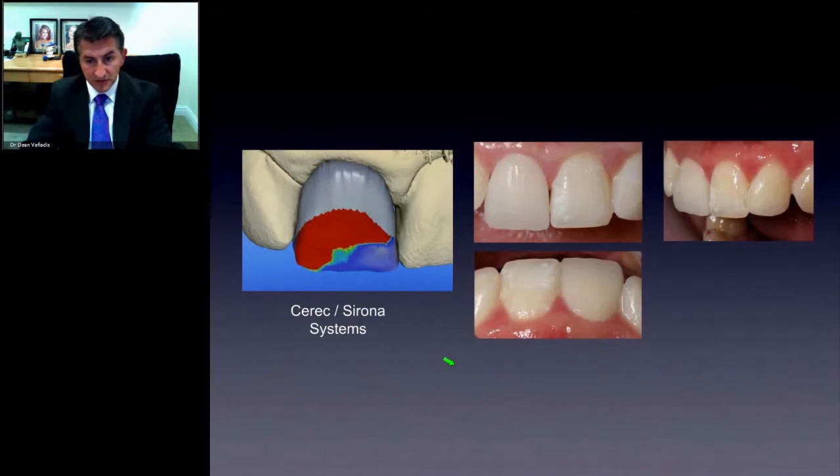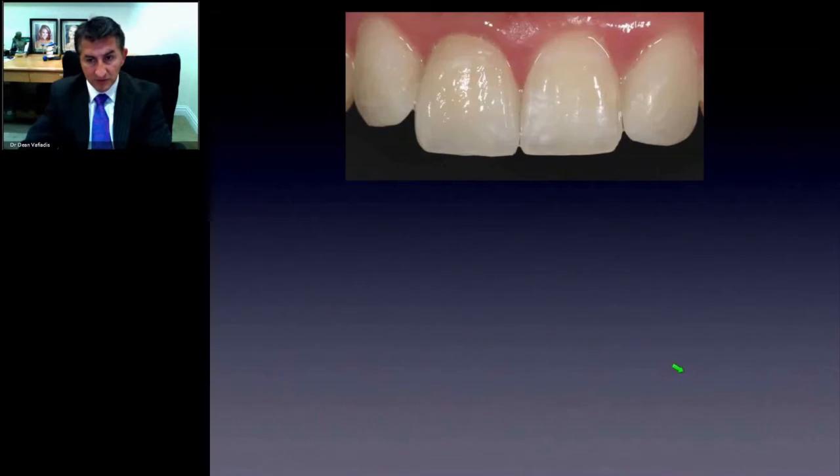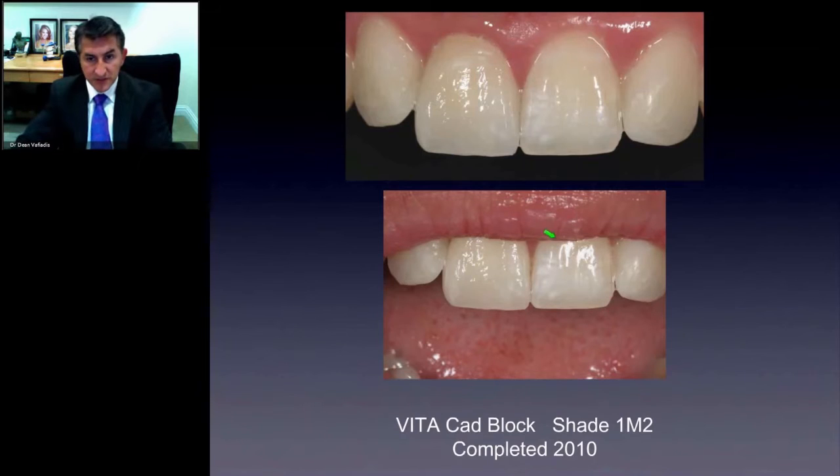You see the shade is matching as a depth shade. We're going to do this later with all the different stains that they have. We're just trying to get the shape and the incisal translucency, the angles, to be in the right position. Once we do that, we use a little bit of stain and glaze, and you see here I've added a little bit of check lines with the white. I put a little A2 shading at the top, and it really gives us a good view of a nice natural tooth matching the other tooth there.